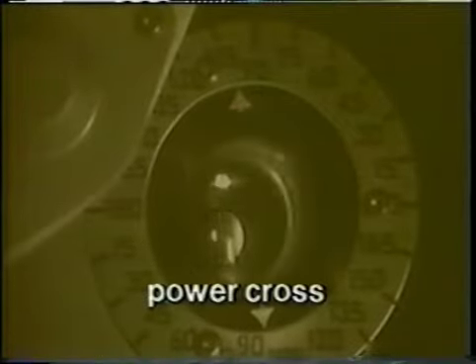Refinement of the cylinder axis using the straddle cross is recognized as one of the most accurate steps in retinoscopy, and as you see, is both easy and fast. Next comes final refinement of the cylinder power. Again, we move in a few centimeters from the normal working distance to pick up definite with movement in both principal meridians. Now we use what Copeland called the power cross.